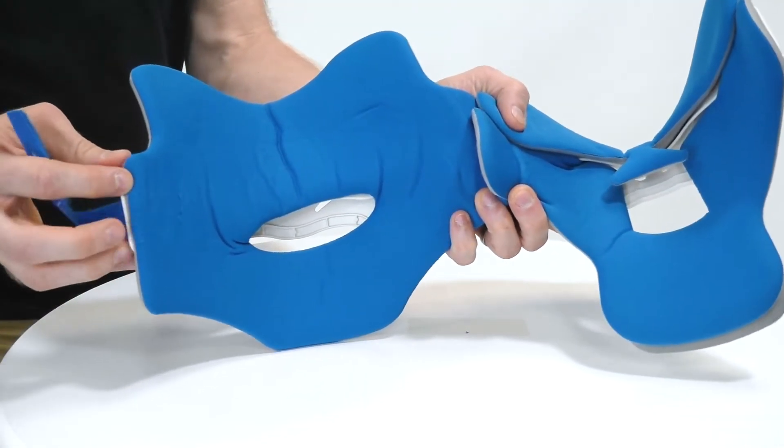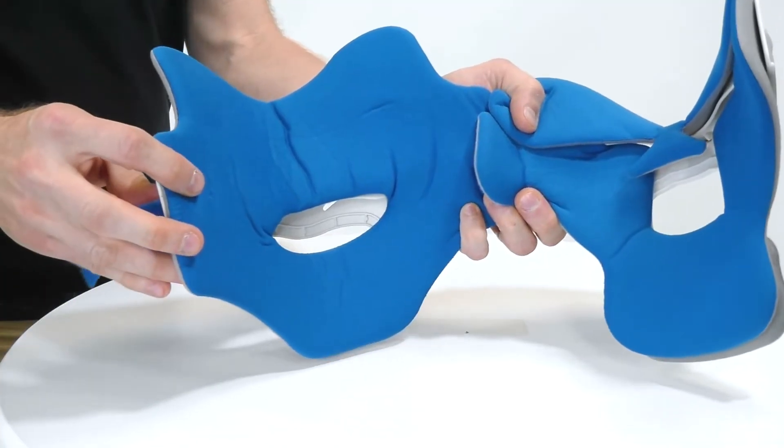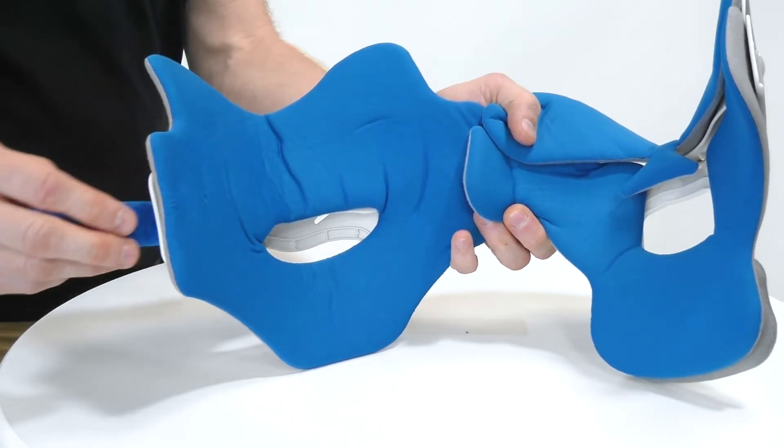As we open it up, the Sorbotex liners are replaceable, antimicrobial and biocompatible.